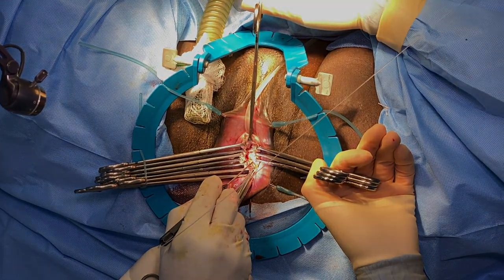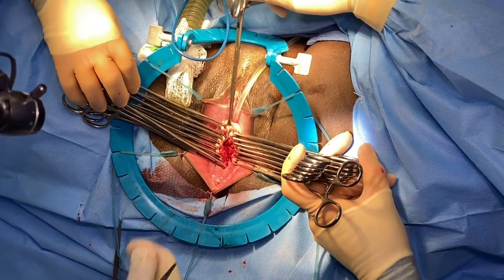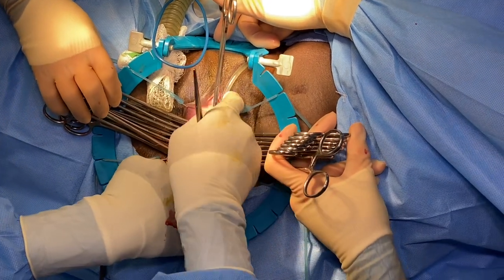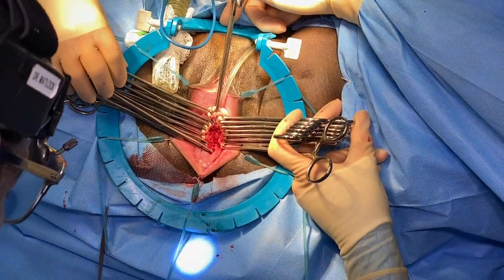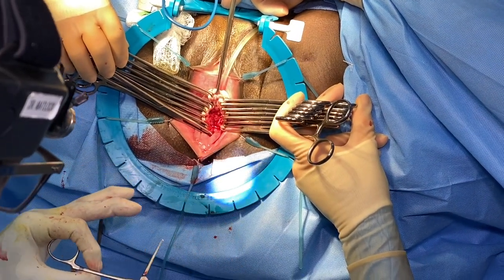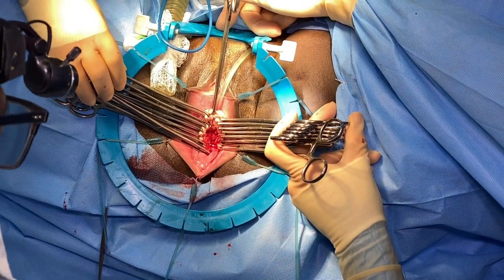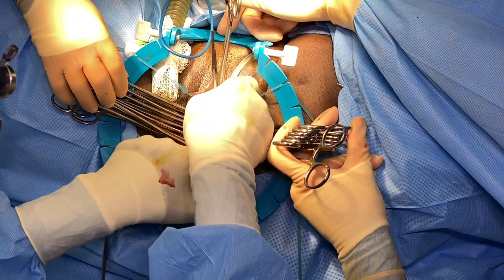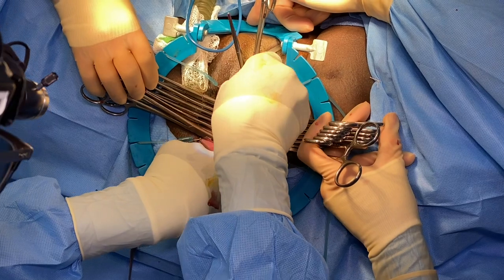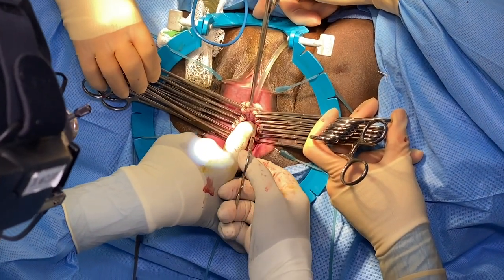We'll bring you back in. Now what I have to do is bring this pubocervical fascia back together to reconstruct this anterior wall. Okay, so I have to stop her stress incontinence as well. I want you to think this is the Foley catheter, there's the balloon, here's the bladder, here's the urethra. So I'm pulling this to determine what we call this urethrovesical angle. That's what I have to support, and all along the urethra to stop her problems with stress incontinence. I'm going to get good bites in the tissue.